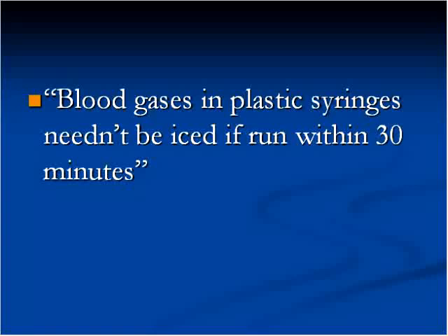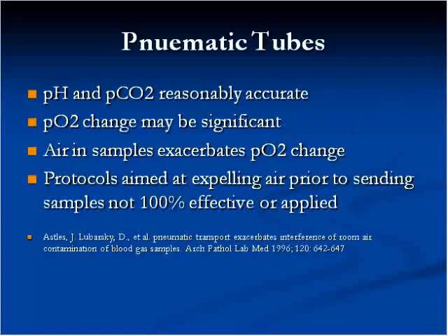But it's also interesting to note that air in the sample could decrease the PO2 if you were to get an OR sample where a patient was on 100% oxygen with normal lungs and perhaps had a PO2 of 300 or 400 in the OR. So it tends to migrate towards 150. So, as I said, we want it to be anaerobic, and air can lead to error.